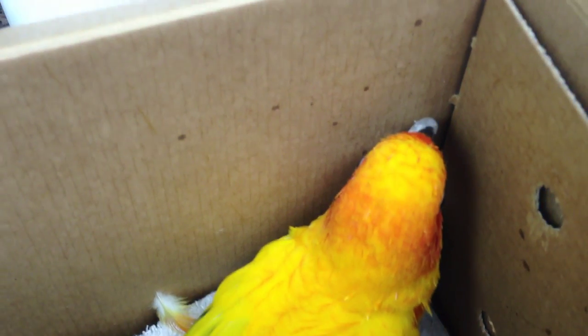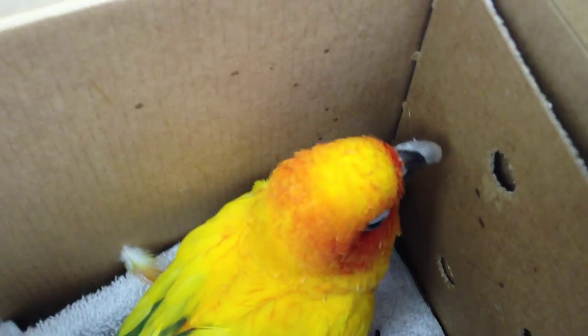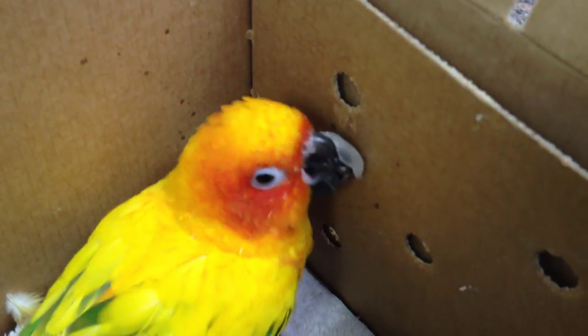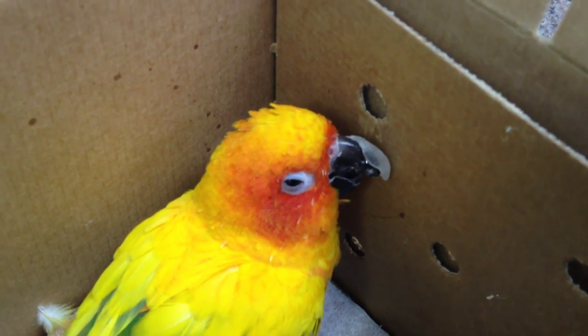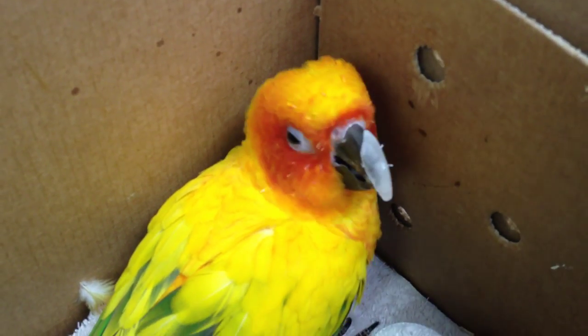They've actually gone through the beak. I did not want to do that the first time — tried to be a little less invasive. I even used a human nail product this time because my girls swore that what I was using was just not the right stuff. It's an acrylic beak. What that's meant to do is keep that lower mandible from popping off to the left too much, and it'll hopefully, like an orthodontist, move it more to the right and make it more normal.